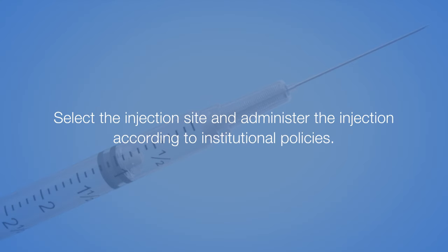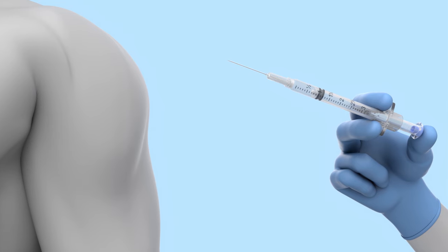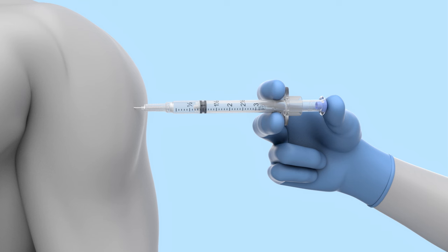Select the injection site and administer the injection according to institutional policies. When injecting, place your index and middle finger under the flanges and fully depress the plunger with your thumb.